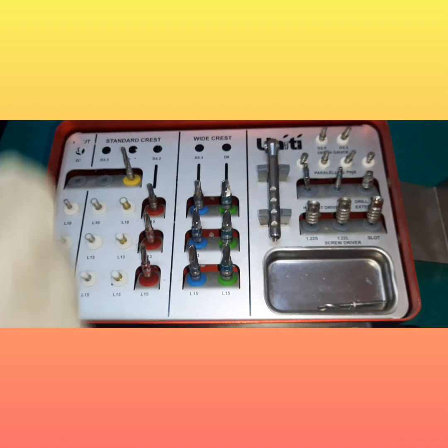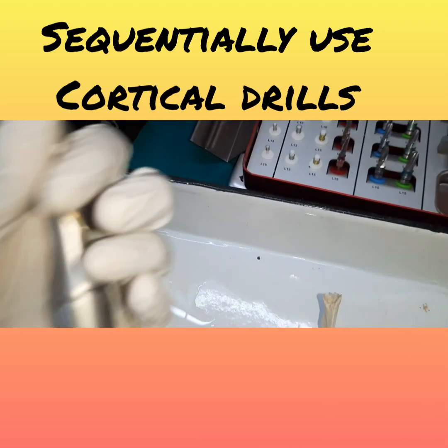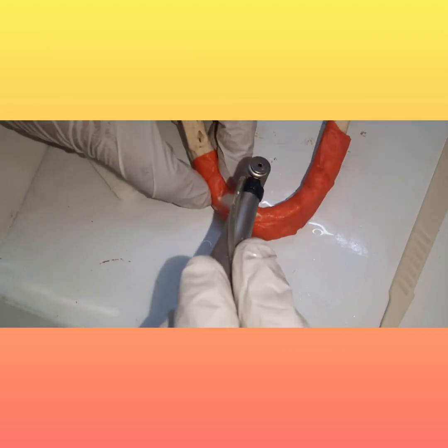Next we'll take the second drill, that is D 3.3 millimeters, and we'll go ahead. Again we'll stop at the same.